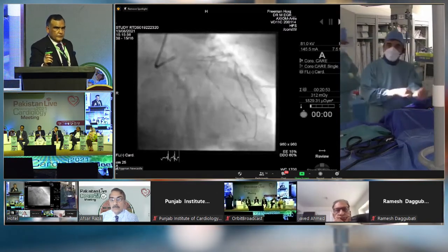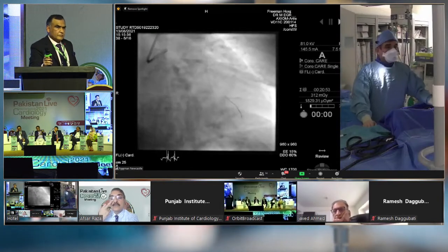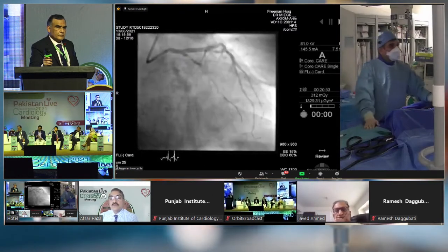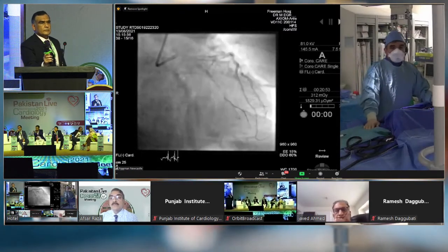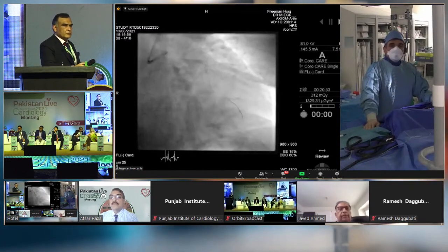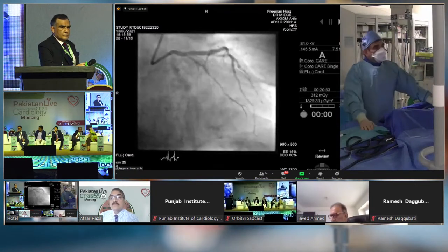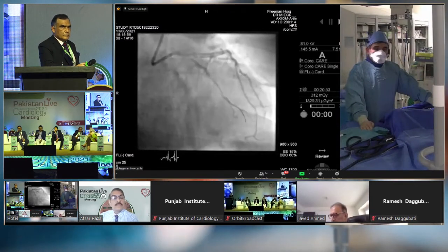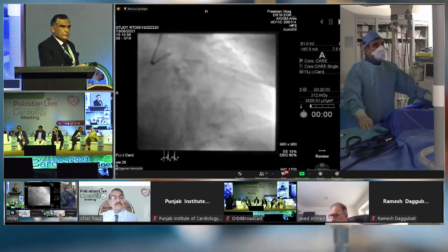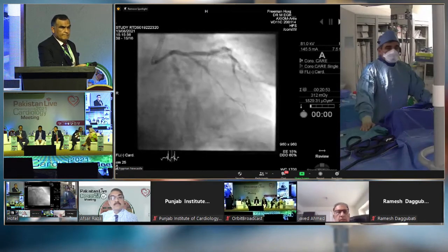Hi, good afternoon, and welcome to Newcastle again, and many thanks for the opportunity to present to you. Unfortunately, we can't be there in person, but hopefully we can show you a nice case this afternoon. We have a lady who is 69 years old who had an inferior myocardial infarction 4 weeks ago. She had a primary angioplasty to her right coronary artery. Looking at the left coronary system, she had severe left main stem disease extending into the LAD and the circumflex with heavy calcification and an aneurysmal dilatation at the bifurcation of a medium-sized diagonal.